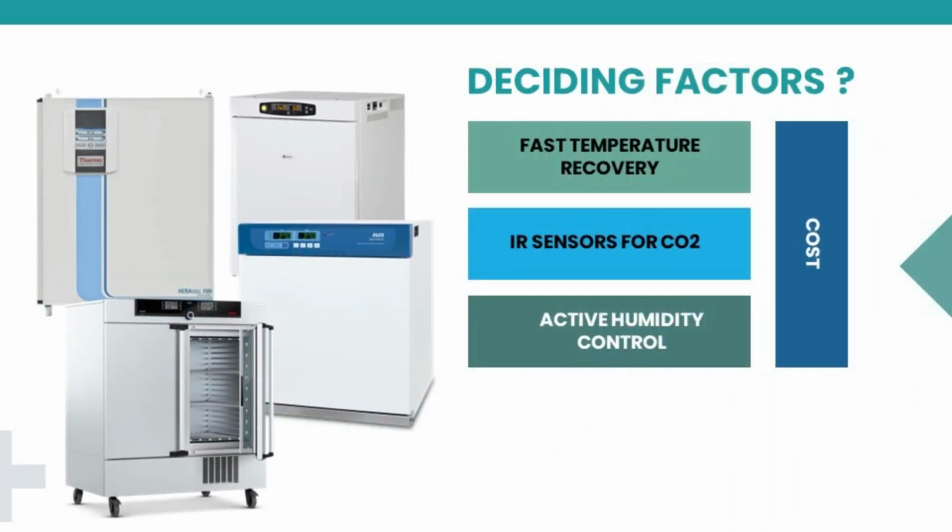So now, finally, what would be the deciding factors for you to choose a box incubator? I think the first and foremost factor is it should have a fast temperature recovery, it should have IR sensors for CO2, and it should have an active humidity control. And of course, above all, the cost.